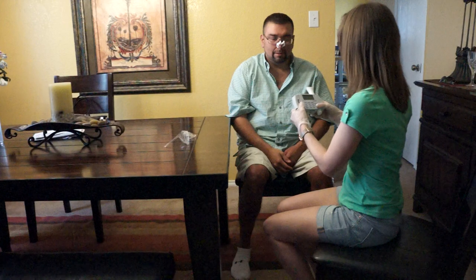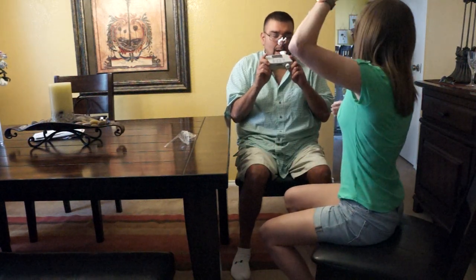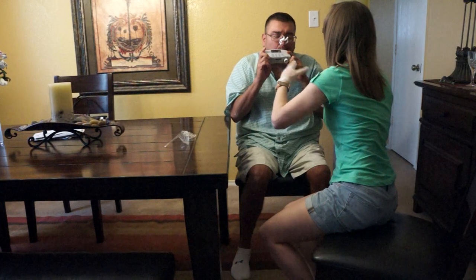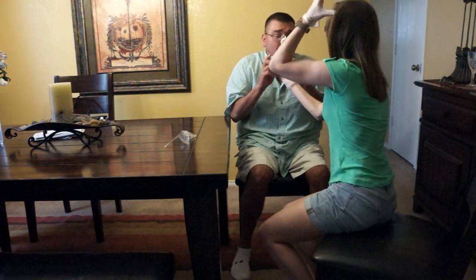Okay, are you ready? Big deep breath in, all the way to the top. Good tight seal, blast out, hard and fast. Go, go, go. Keep going, keep going, keep going. You're doing good. Keep going. Good. Big deep breath in.